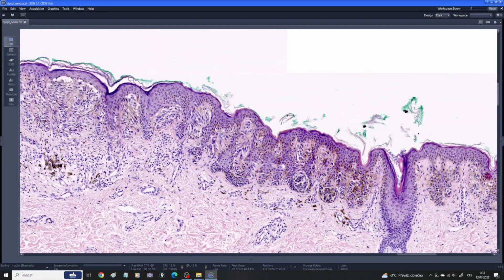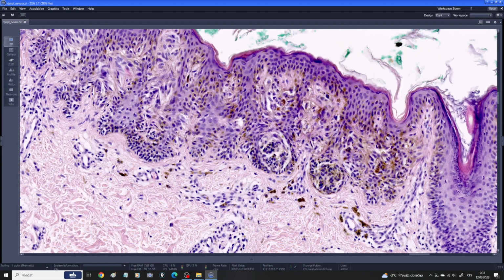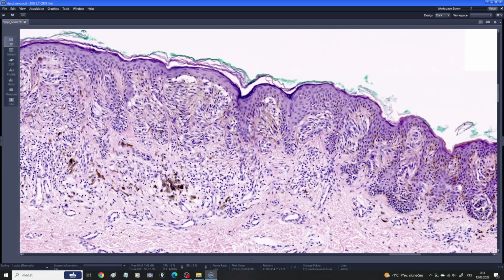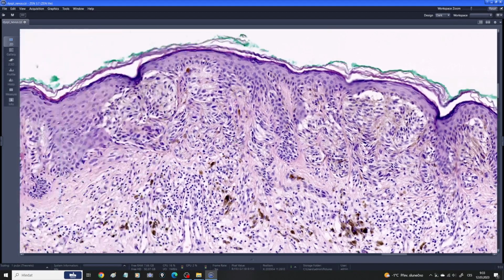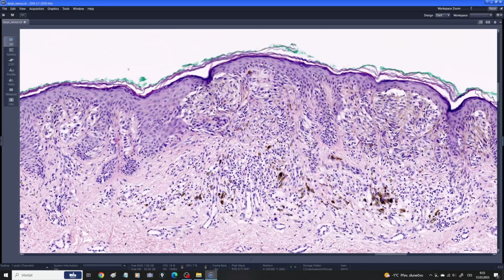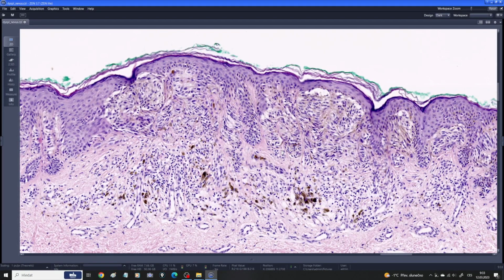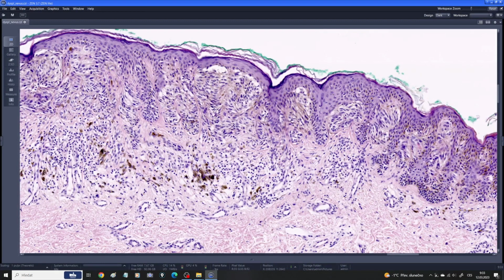And second, you can see also architectonical atypia. You can see that some of the nests of the tumor are quite regular, but some of the nests are really irregular. They vary in shapes and sizes, and what is very typical for dysplastic nevus, and basically that's how you recognize it, is this fusion of the nests, this merging of the nests.